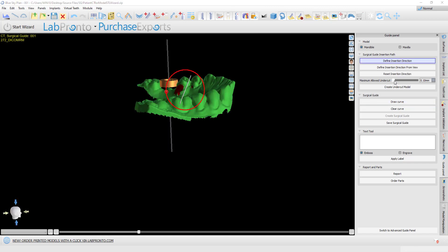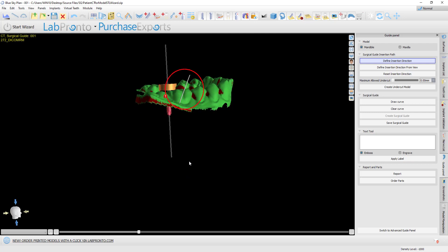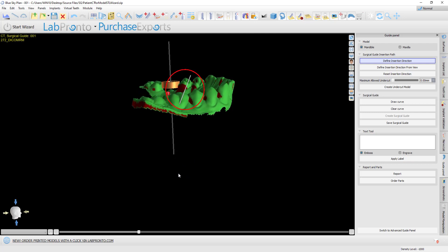We also have the 'maximum allowed undercuts' slider, meaning that if you want to leave a bit of undercuts for more of a snap-on effect, you can adjust it. If you set it to 0, all undercuts will be removed.